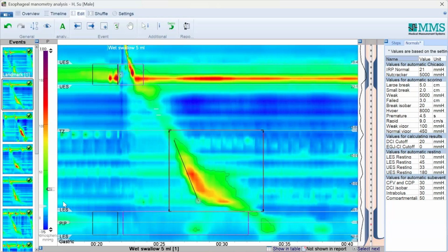It's still within the borderline. Because even before, when they considered 20, the normal was 15. There was some standard of 15. Some are saying it's 20 because we have two types of manometry.